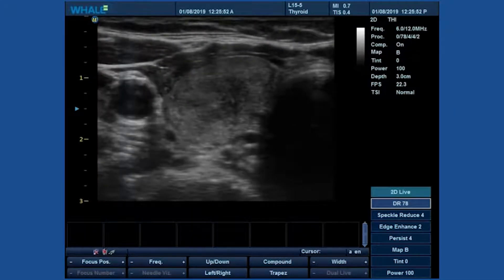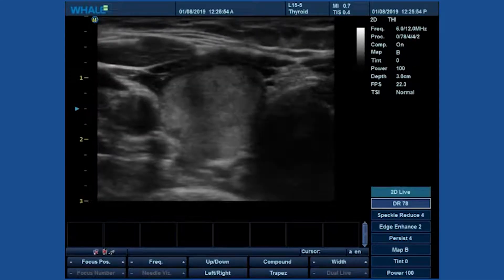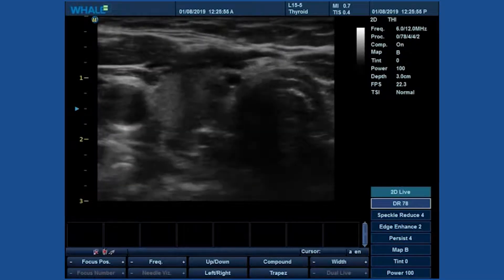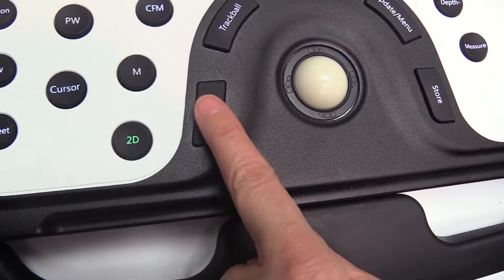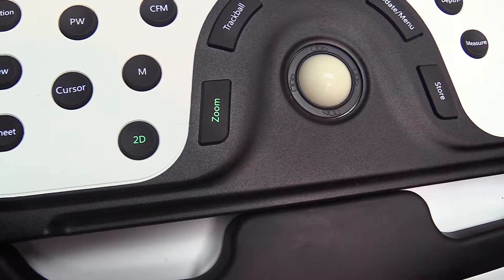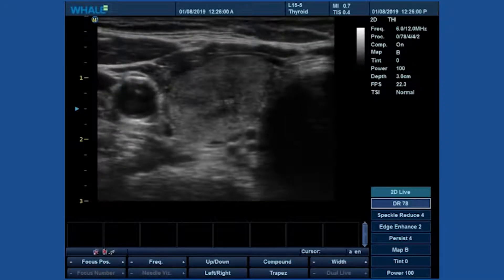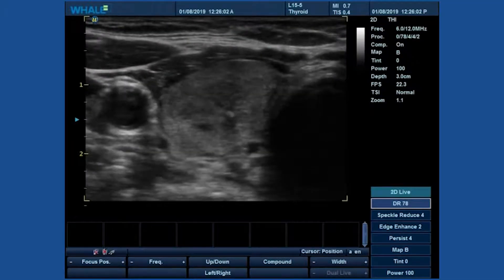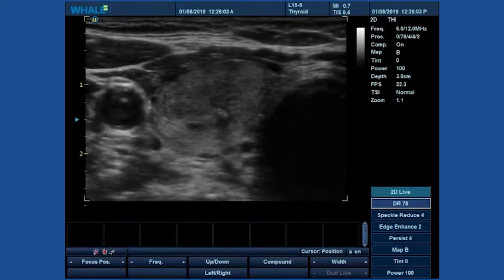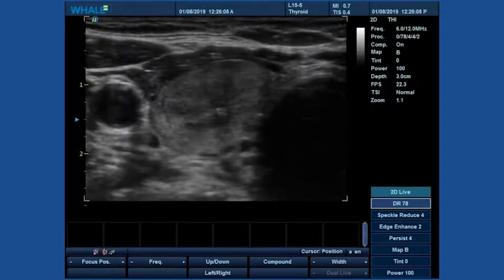I try to start with the area of interest in the center of the screen, then activate zoom. Notice the corners on the image — these indicate that zoom is on and this is your ROI boxed area.